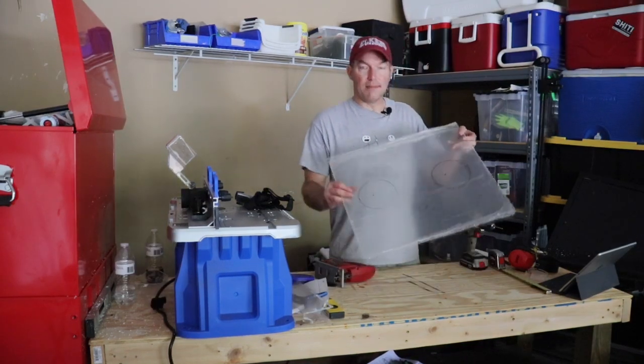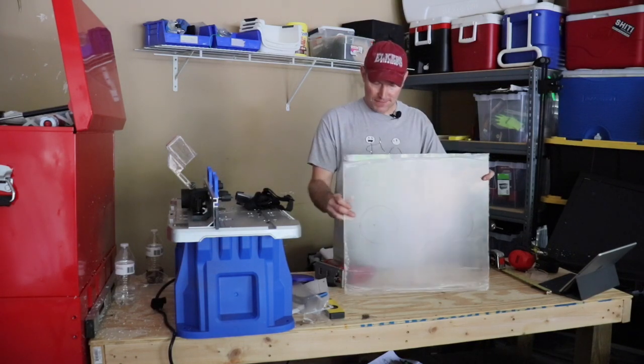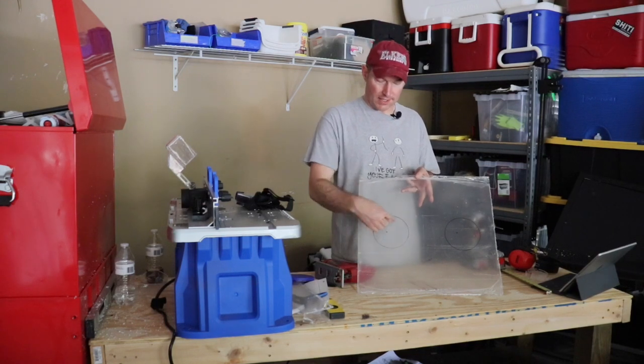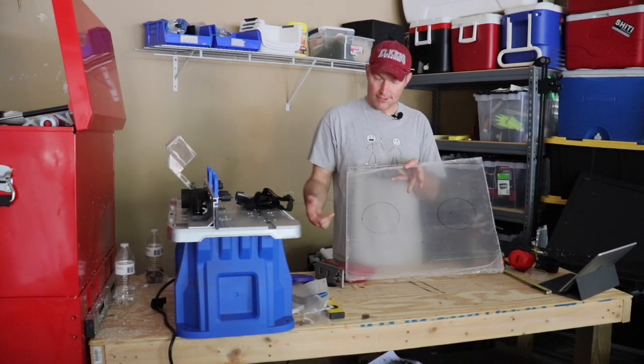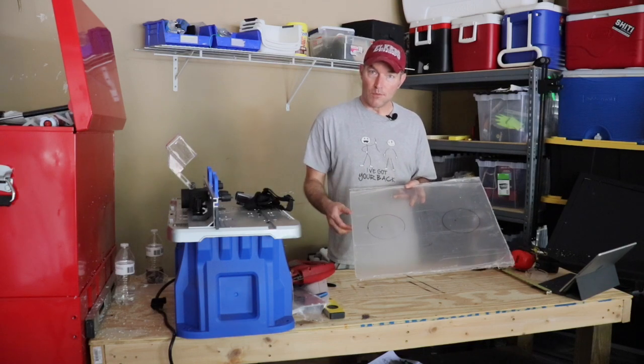So now, as you can see, I got my hand holes here. I'm going to cut these out and see if I like them. I'm going to drill a pilot hole, then use a jigsaw to cut the circles. If I don't like the way these circles feel, what I'm going to do is just extend it as one big open piece right here. So let's drill some pilot holes so we can get that jigsaw in there, and then we'll get to cutting.